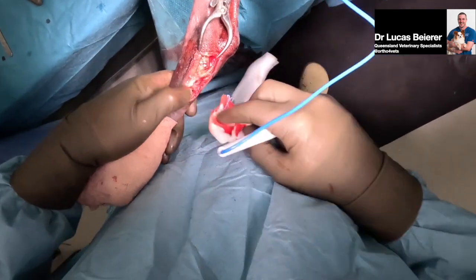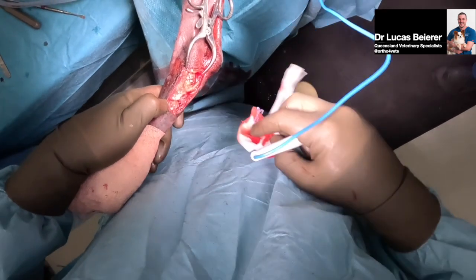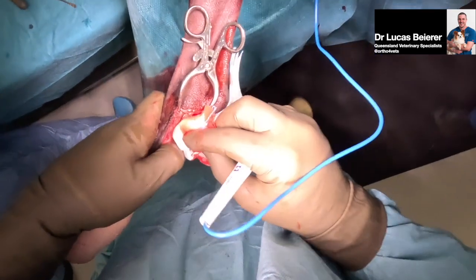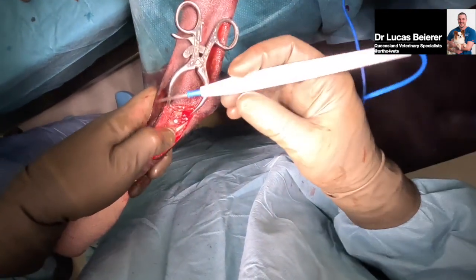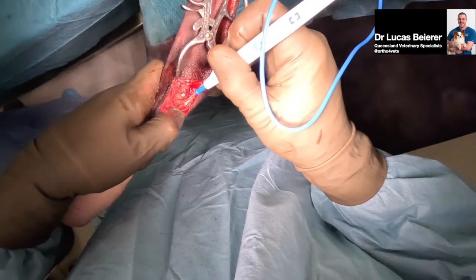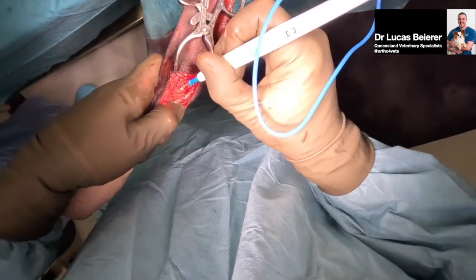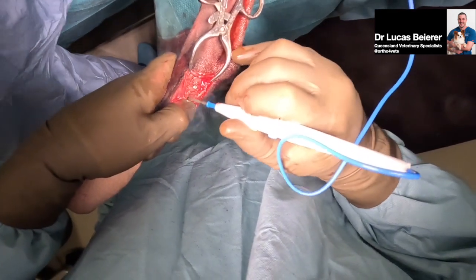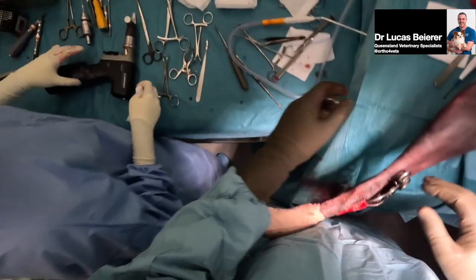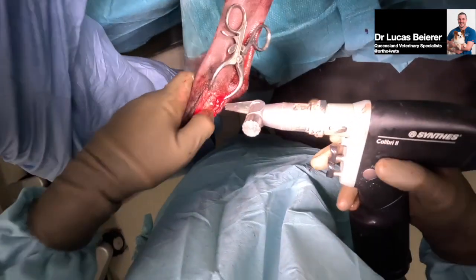So we've just cut off the top of his metatarsal to give us a bit of a surface to plate onto, and then we'll cut this guy off to create a bit more of a contour here as well. I wonder if I should have thrown this fragment in the bin. Would have made a nice flat surface. Maybe that's what we do next time. Fix it and then cut it.